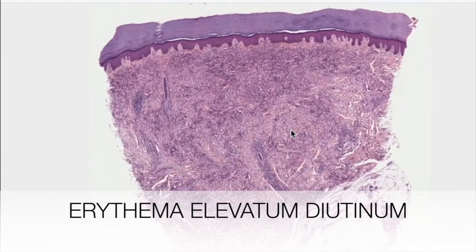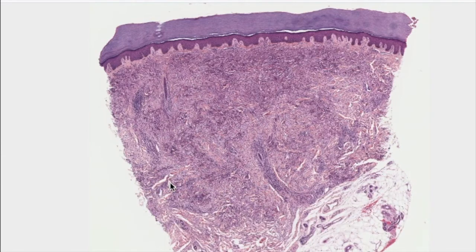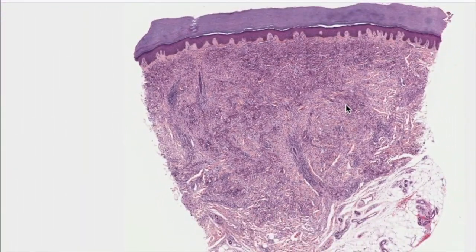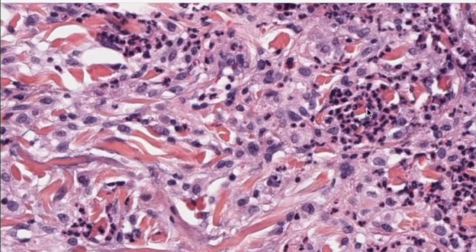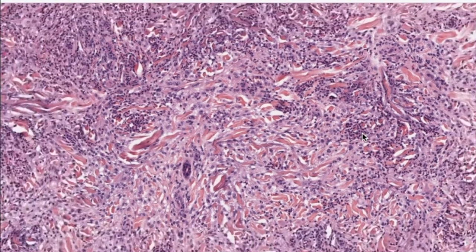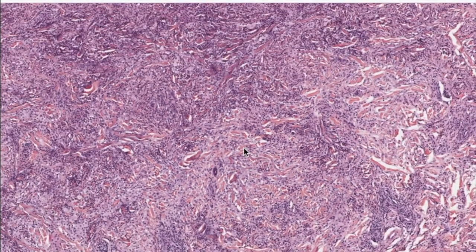As we said, clinically it's long-standing and it has this kind of elevated erythema borders. So Erythema elevatum diutinum is basically an infiltrate with neutrophils around the vessels and with this collagen. If the lesion is chronic, it can become more sclerotic, and you will see the collagen pulling away from the lesion, leaving those white spaces.